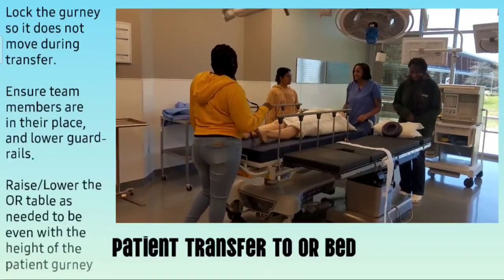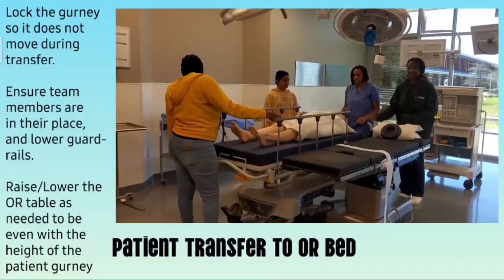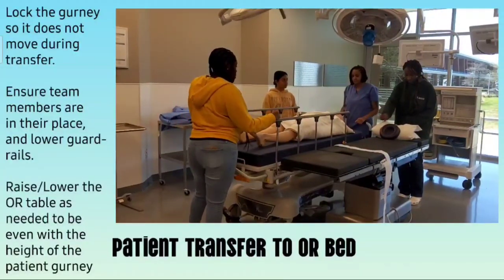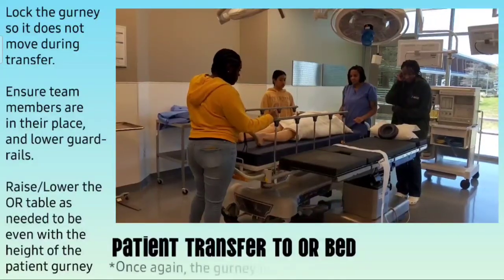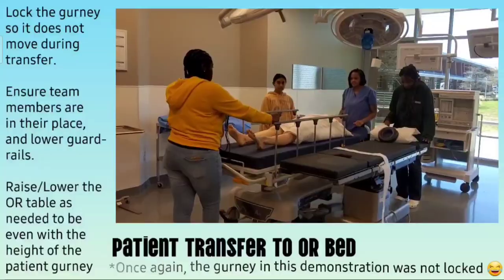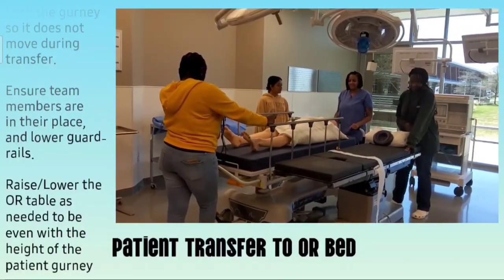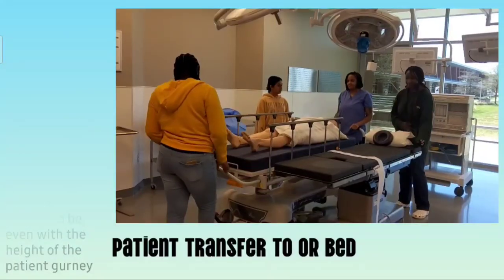The essential steps in completing the transfer of the patient is to have the stretcher right next to the OR bed with the wheels locked. One person must stabilize the stretcher while another stands on the opposite side of the OR bed to receive the patient.